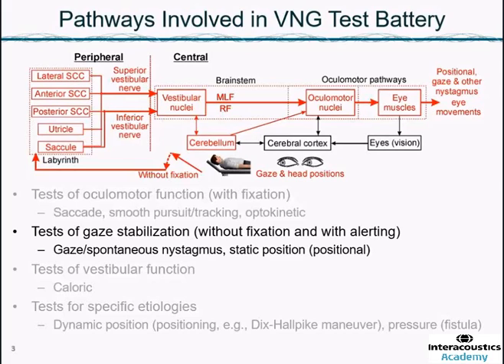Oftentimes with things like spontaneous nystagmus, you have other findings that will clarify the localization, but if you're interpreting them on their own, these are non-localizing findings.